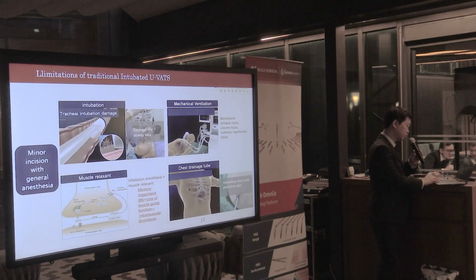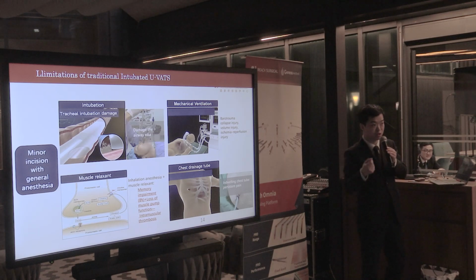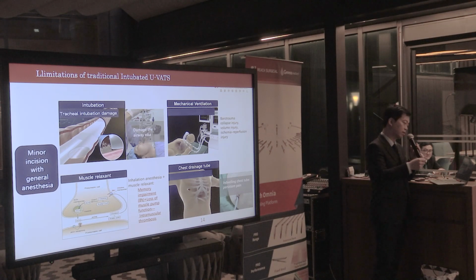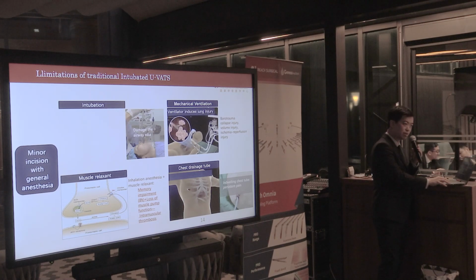There are some limitations of traditional intubated uniportal VATS. If the patient receives uniportal VATS, he must also receive intubation, and traditional intubation will damage some tracheal tissues. Secondly, the patient also must receive mechanical ventilation, and some chest tubes will cause chest pain. So how should we make it better?